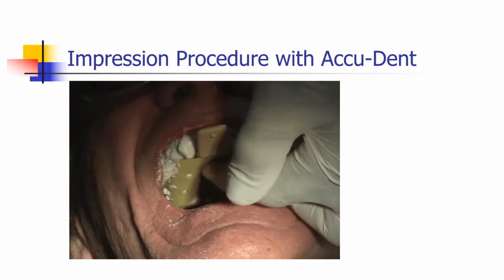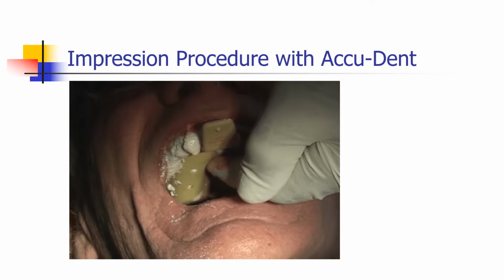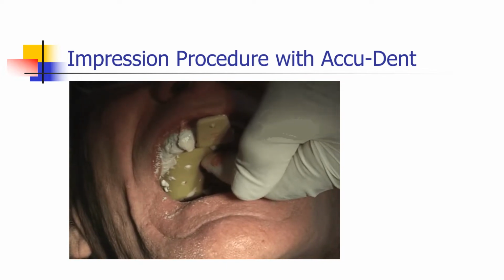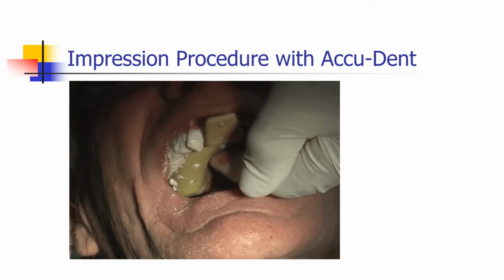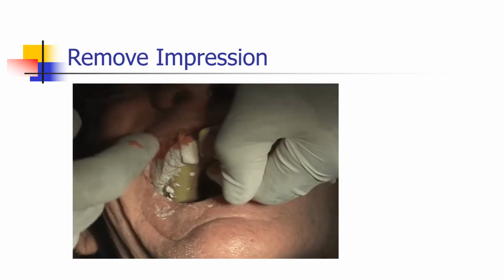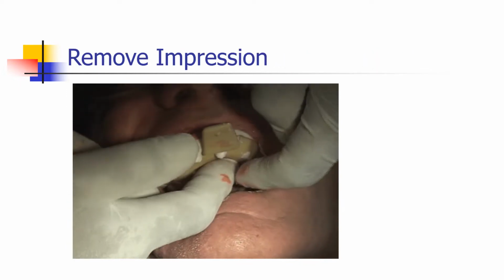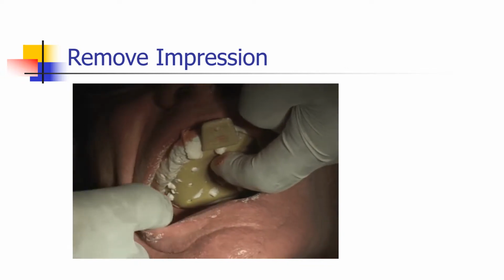It takes only a couple minutes to set up, but you can see how one operator did this mixing. I mixed the light body and the heavy body, and still had plenty of time to seat this into the patient's mouth. The material is already setting up. It sets up fairly fast. As you can see, it doesn't roll down the patient's mouth.